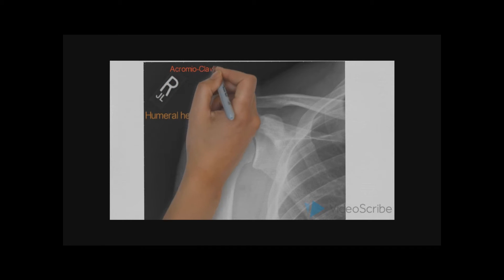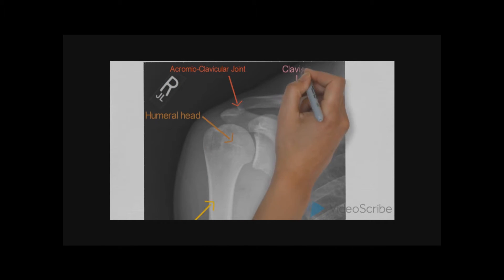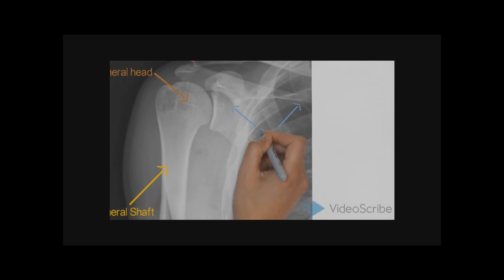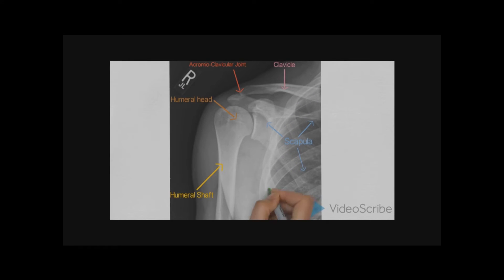We need to identify the position of the normal anatomical structures. First, we start with the humeral shaft. Then we move across to the humeral head. Then we look at the acromioclavicular joint, the clavicle, the scapula, and the ribs.